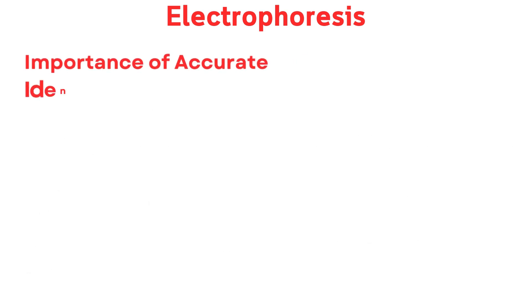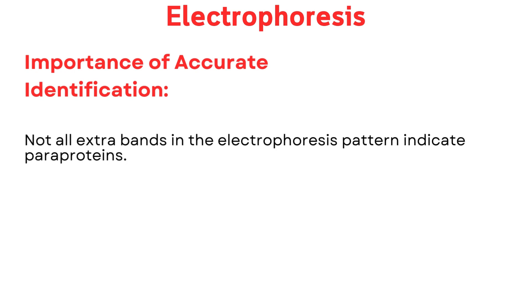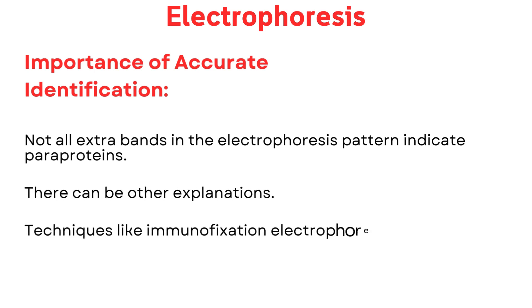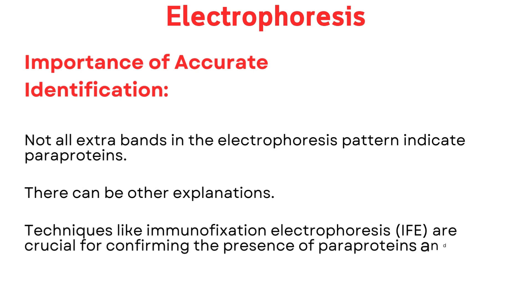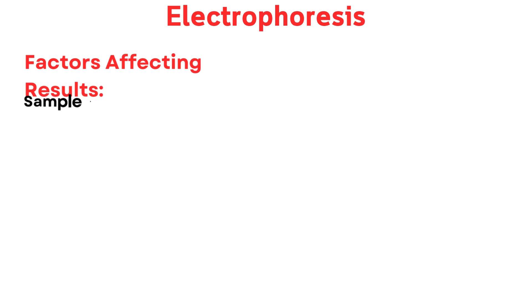Importance of accurate identification: not all extra bands in the electrophoresis pattern indicate paraproteins — there can be other explanations. Techniques like immunofixation electrophoresis (IFE) are crucial for confirming the presence of paraproteins and distinguishing them from pseudoparaproteins. Factors affecting results include sample quality — incompletely clotted blood can introduce fibrinogen, causing interfering bands — and protein variations, where genetic or other modifications can cause proteins like transferrin, haptoglobin (HP), and C3 to migrate differently in the gel.